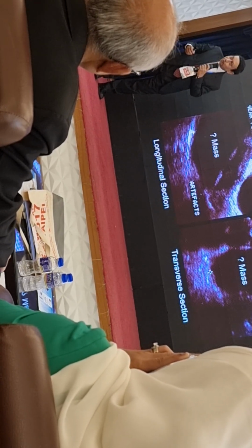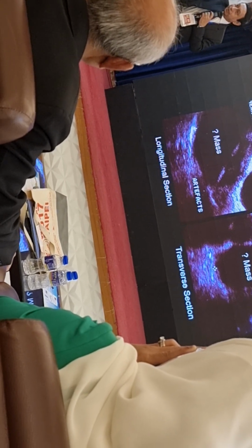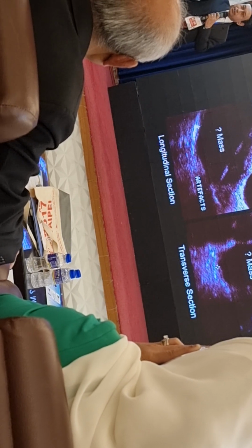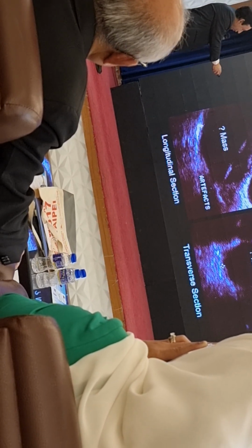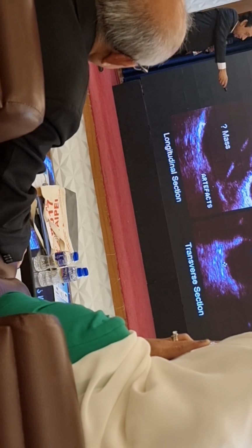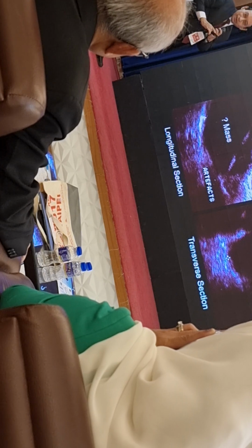And in ultrasound, we used to say that if we scan in two perpendicular planes, then we can solve most of the problems. But you see, this is a long section, this is a transverse section, but still there is a mass. So how can we avoid it?